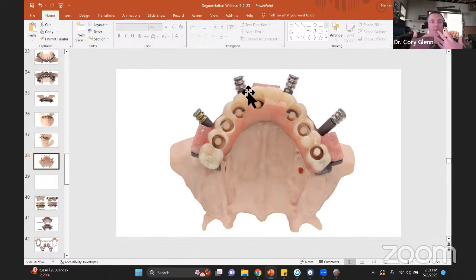So for example, if you use a cheap scanner and it's not detailed enough to capture the contours of the teeth, now you have no bridge or way to stitch it back to your intraoral scans. And frankly, a poorly stitched facial scan that isn't perfectly lined up is more damaging than helpful. Because now you're planning based on a facial midline, and you don't even know if it's in there right.